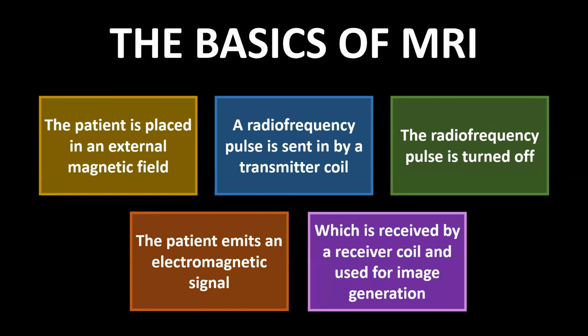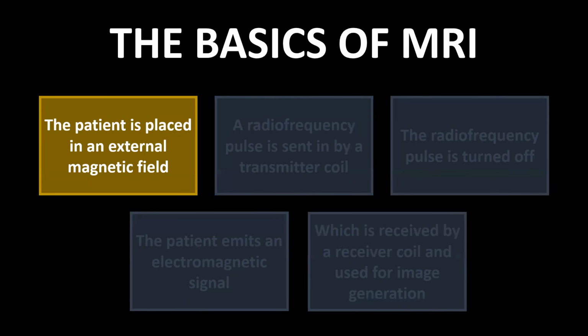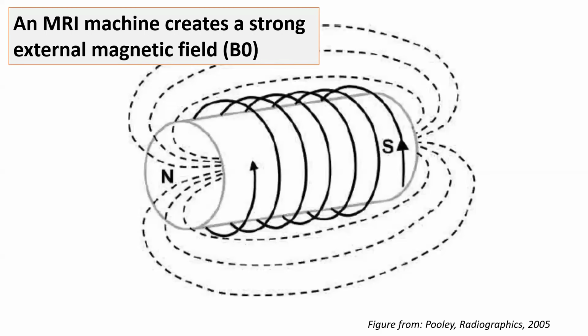Let's go over these 5 steps one by one, the first one being the patient being placed in an external magnetic field.